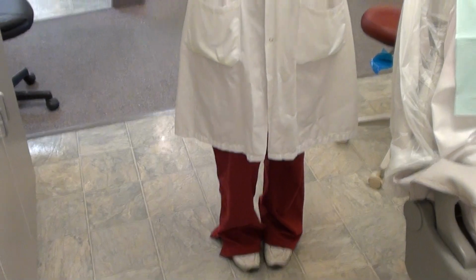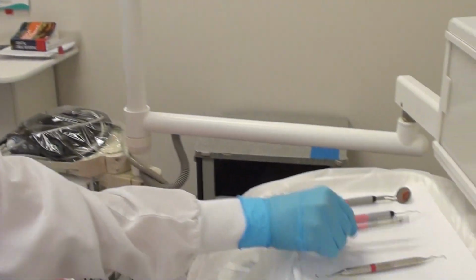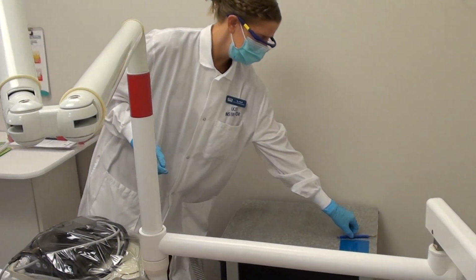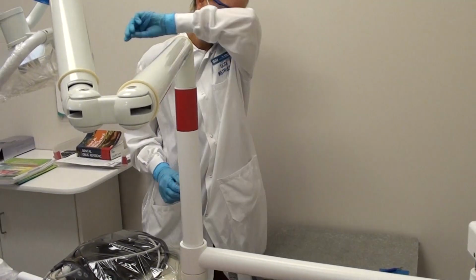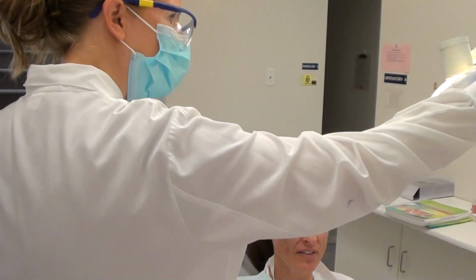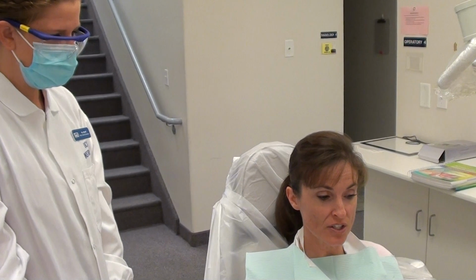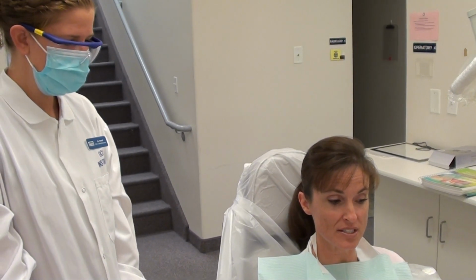She's going to have removed the patient's glasses, and she will obtain a periodontal probe, a barriered pen, and the patient's chart, which is invisibly there. She's going to position the patient upright, have a light for use when needed for maximum visibility and illumination of the structures to be examined. She's going to communicate the procedure and the rationale for performing an extraoral examination to the patient.